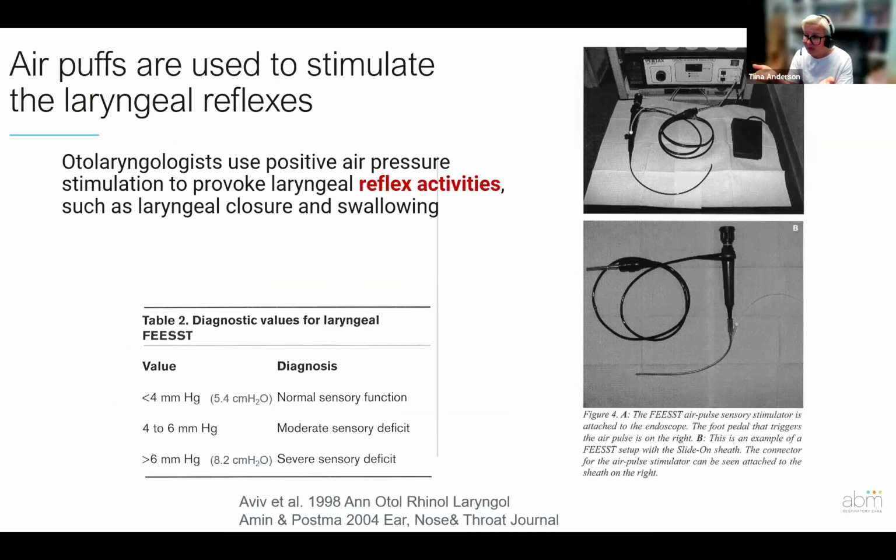And when I saw these positive pressures they are using to provoke this closure reflex, it's only 5 centimeters of water or 8 centimeters of water to show a severe sensory deficit. So it's not strange for them, but for us, whoa, we didn't know this, and we are operating with that much applied positive pressure. Nice to keep in mind.